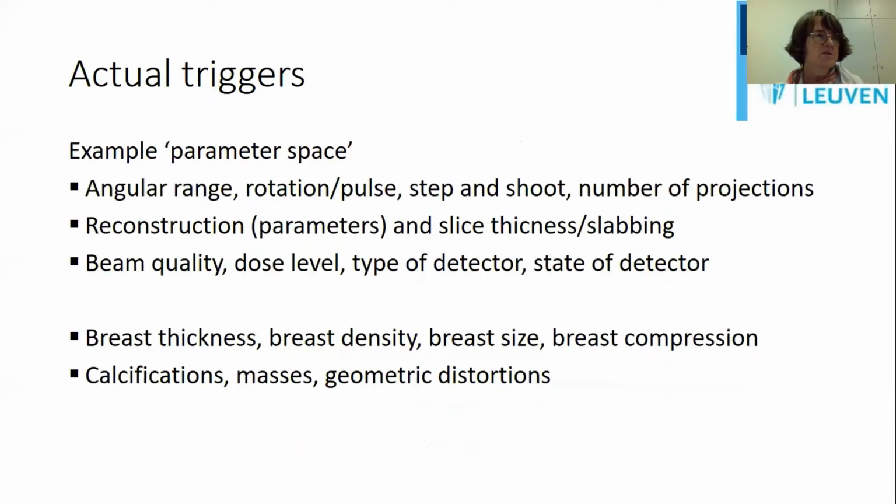If we then consider which types of parameters would come in, there are even many more than in the previous set, where you just want to compare two processing algorithms on a 2D mammogram. Here are just a few. If you want really to improve the synthetic mammography, it starts with improving the tomo.